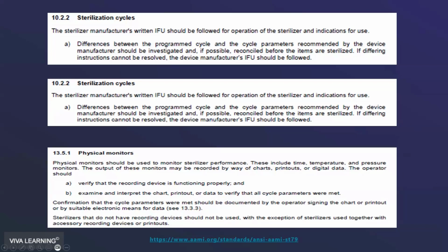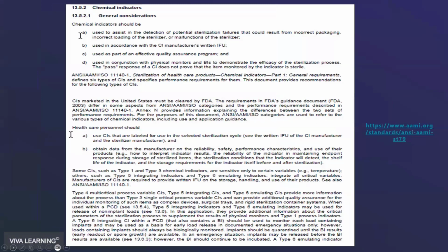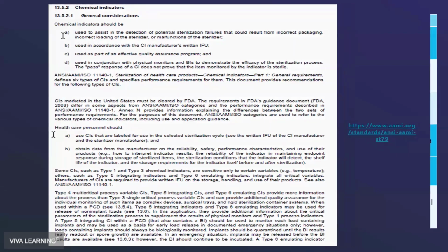Okay, so hopefully that is helpful information. This is some more information that comes from the AAMI standard, and they talk about using chemical indicators in accordance with the manufacturer's instructions. So don't just assume that one manufacturer's chemical indicator strip is the same as another's. Whatever it is that you're using, make sure that you've read the instructions and that you use it appropriately. That is following the standard of care.